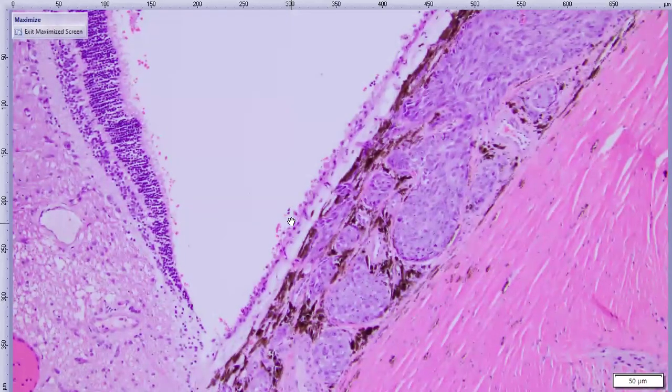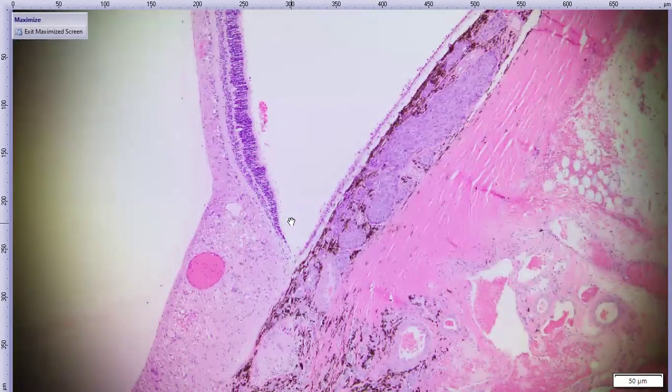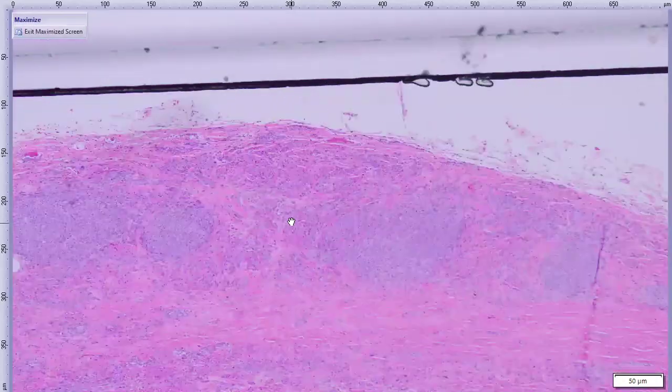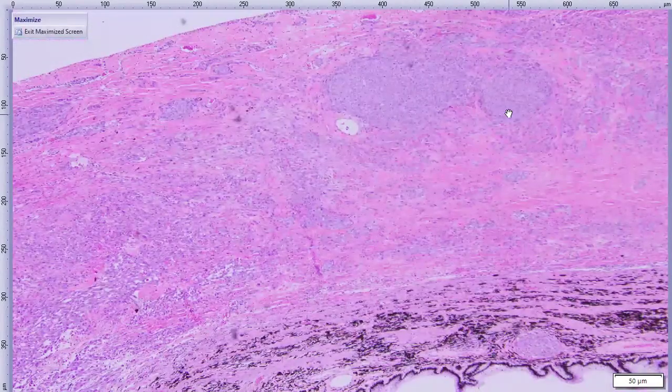So that is also a good indication that this is a tumor that originated elsewhere in the body and arrived via the vasculature. Keep that in mind, because we're seeing the neoplastic cells in the blood vessels that feed the retina. That is where the oxygenated blood would be arriving in the eye. However, up here, we are looking at the veins of the scleral venous plexus.